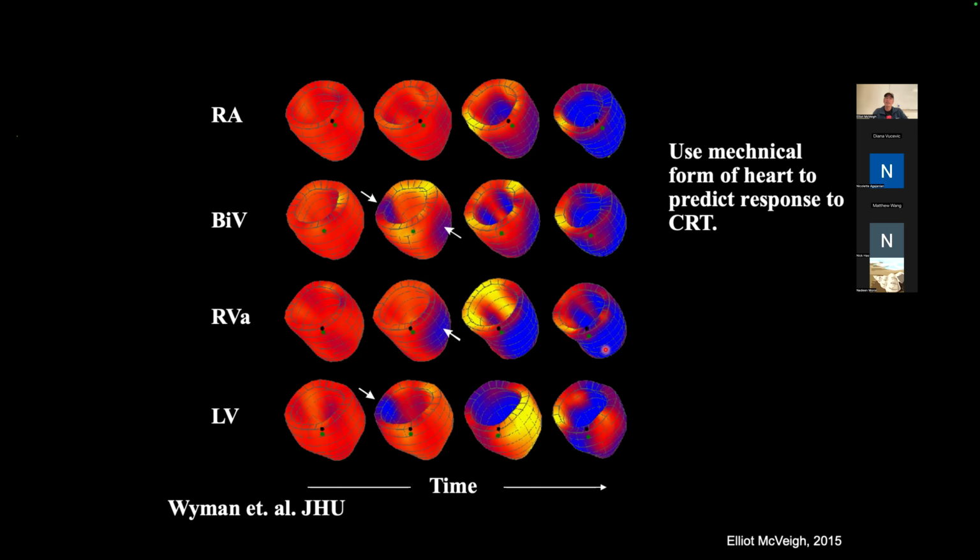And what this is simulating right here is basically a left bundle branch block. And that means that when you have a left bundle branch block, the Purkinje system on the left side of your heart has been blocked off by, say, an infarct or something that killed the tissue along that pathway. And so the activation isn't going normally through the Purkinje system to the left side. So the left side is delayed. The activation moves through the myocardium instead of the Purkinje cells. So that's a classic left bundle.